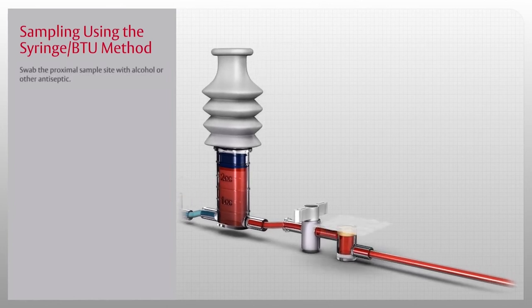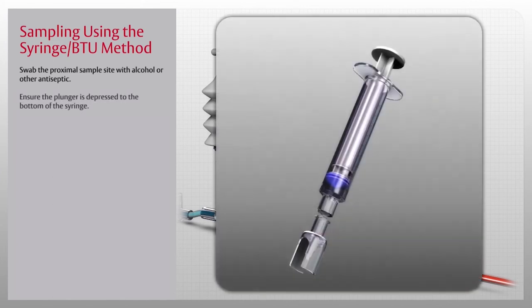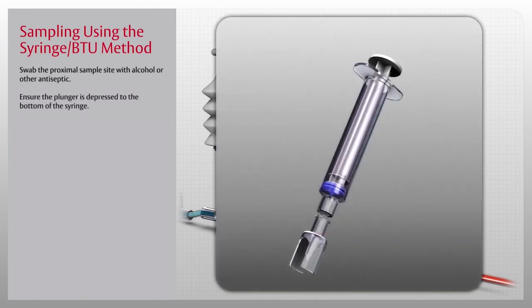To begin, swab the proximal sample site with alcohol or other antiseptic. Then, ensure the plunger is depressed to the bottom of the syringe.